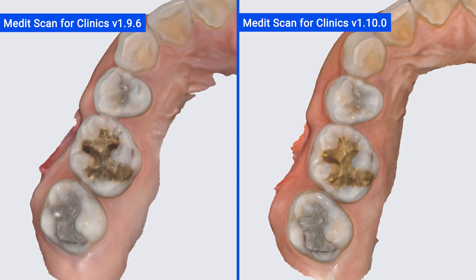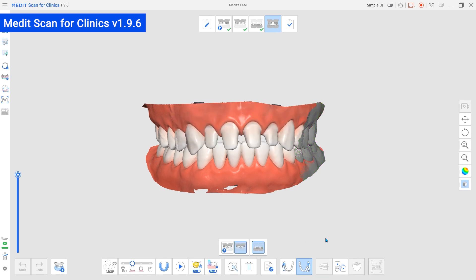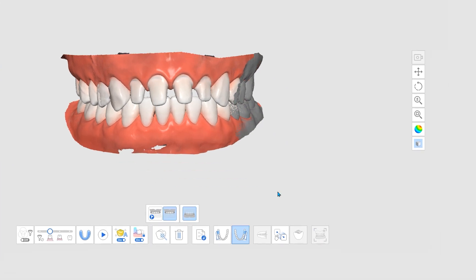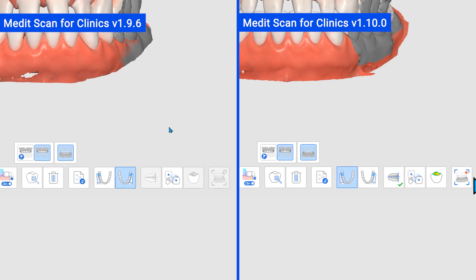The processing speed has also been improved, so you can see the best results faster. We have some improvements in the occlusion scan stage. Previously, certain features would become disabled if you changed the occlusal targets. But now, even after changing them, you still can use the Align to Occlusal Plane, Occlusion Analysis, and Mandibular Movement features.